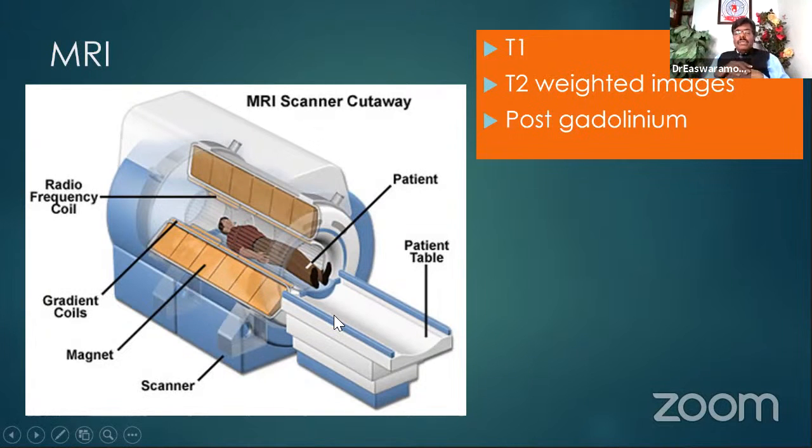Even I had one MRI last year, and it is very claustrophobic, I tell you. For 15 minutes you stay there with a loud noise, as if somebody is hitting your skull with a stone, because it makes a noise every time. The spinning of the hydrogen atoms, because of the magnetic field changing, gives you a loud noise. Even though they plug your ears with cotton, the noise is still uncomfortable, and the stay is unforgivable. I don't think you will stay. So the patient has to be really motivated to go into this tunnel. So MRI is done in a tunnel.